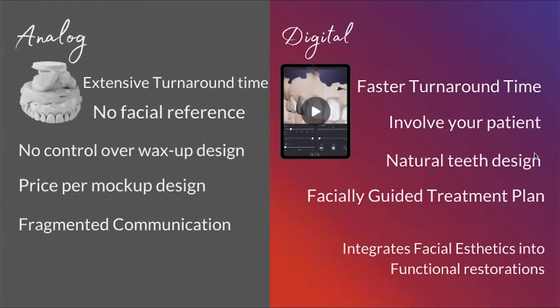So what you're going to be learning today is how to have a better communication with everybody that is involved in the treatment, especially the patient. You will learn how to create digital wax-ups, which will give you faster turnaround time. You will learn how to involve your patient in the treatment. You will learn how to select from different 3D teeth designs and how to integrate facial aesthetics into your functional restorations.